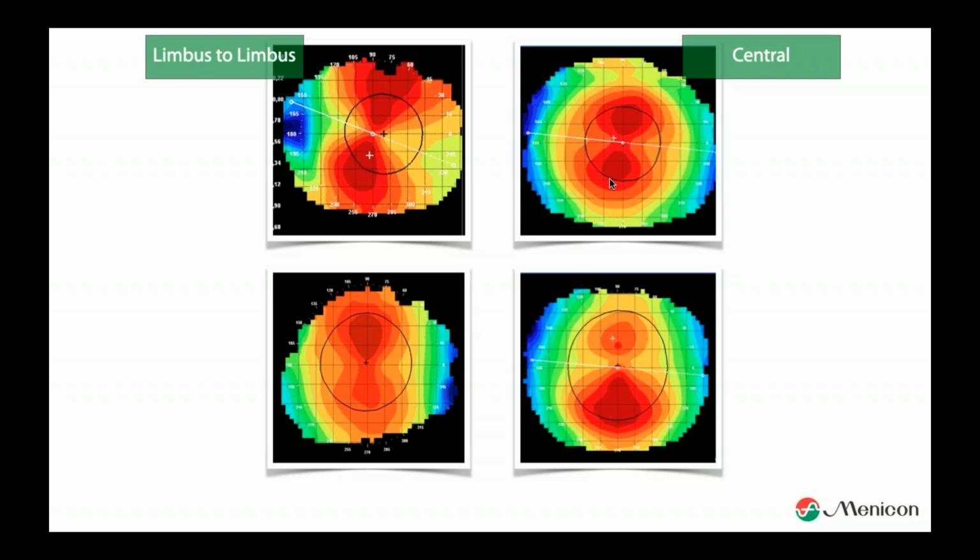And if we go back to one of the first slides where I mentioned, keep in mind that the fitting philosophy in the future will be different, that we will still fit more on the periphery. Maybe you have to make different approaches in the lens fit. You could end up with a situation where the astigmatism in the center area is the same, but the periphery is different.